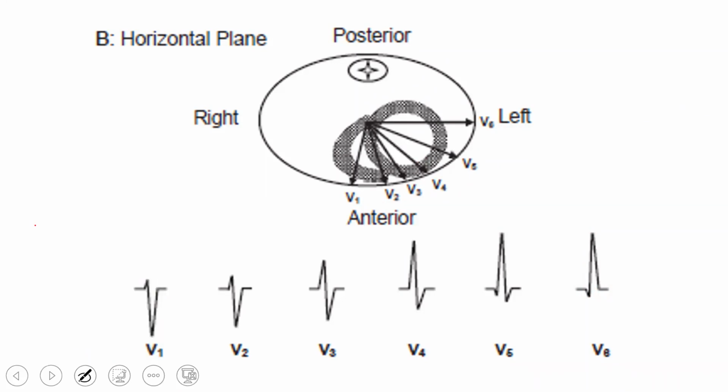Here, in V1 we'll consider now, V1 and this impulse, like this wave, why it is formed, okay? So V1 is a camera which is going to face the anterior part of the chest along with your RV, okay? See, it is too complicated in the anatomy, like where the bundle branches are passing, which is the first twig coming out. That time I told you the same way.